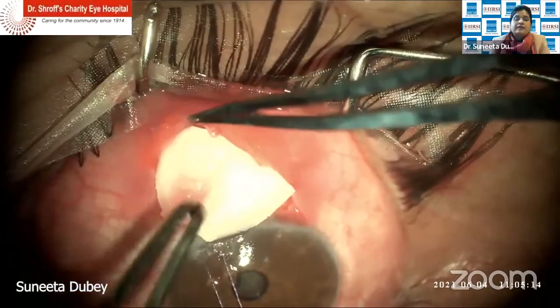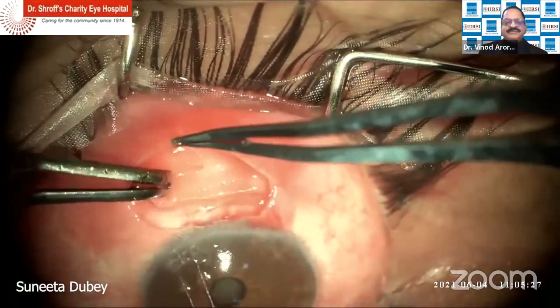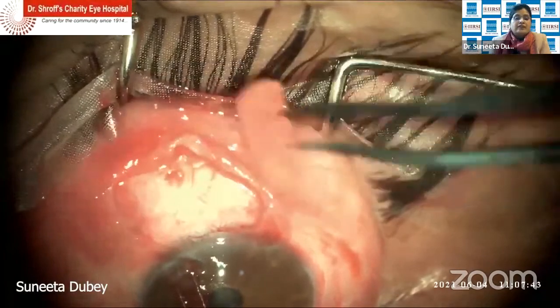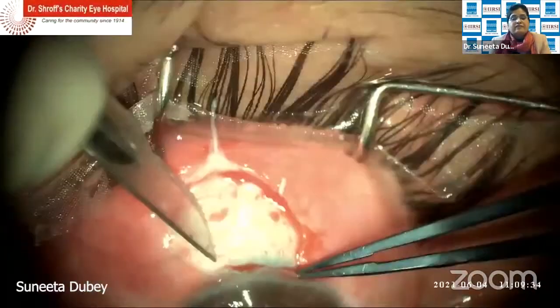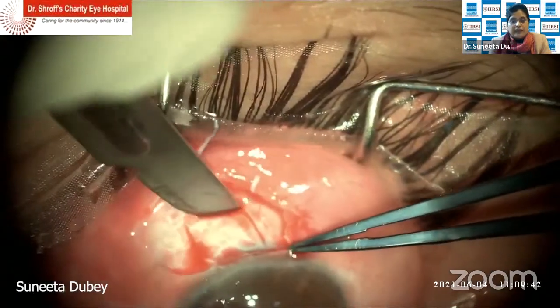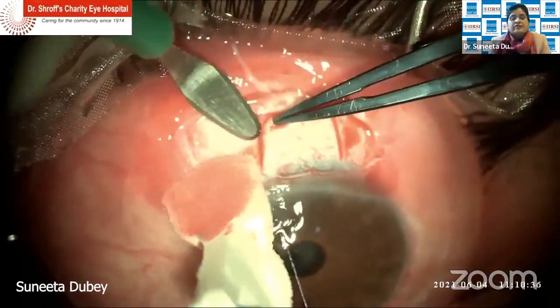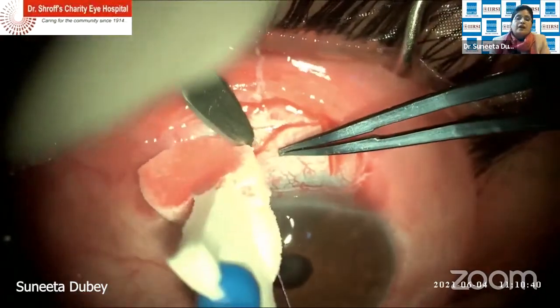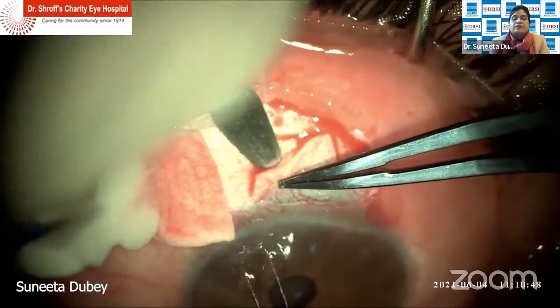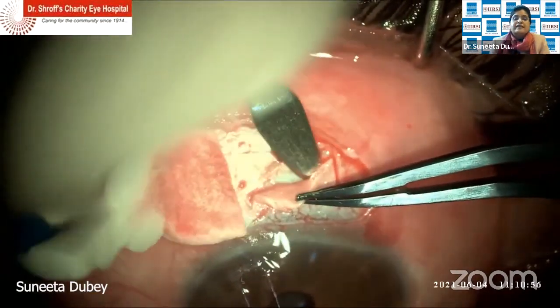So now I think this has been done. Yes. Into the scleral flap, which, we know, is a flow resistor, and you need to have a very robust scleral flap. The size, shape and thickness all matter to some extent. I'd like to now know what kind of scleral flap do you make, what thickness, and what are the factors you keep in mind while making the scleral flap.